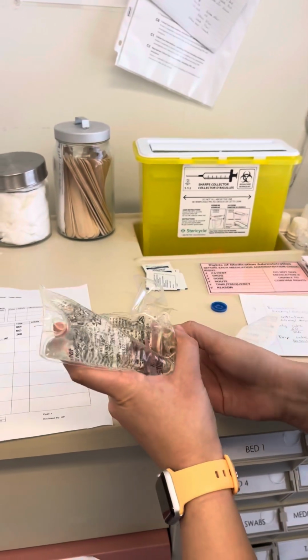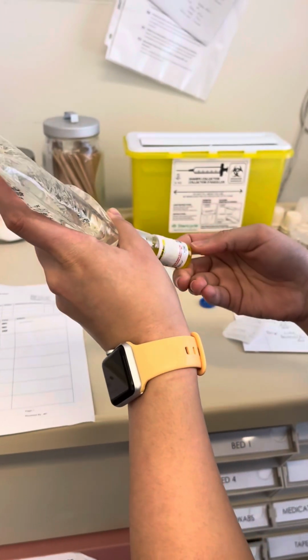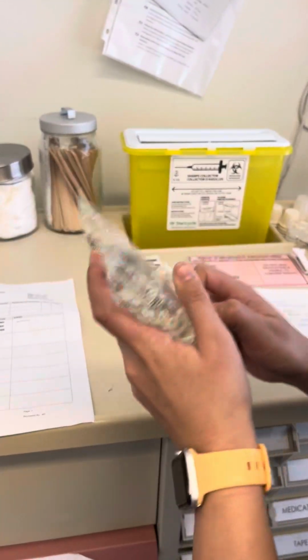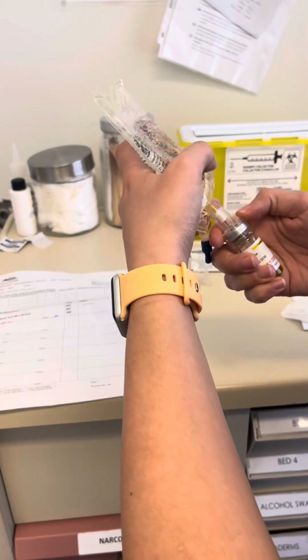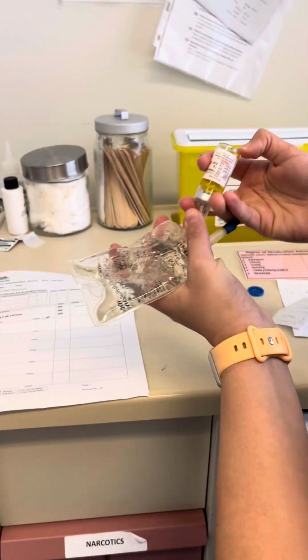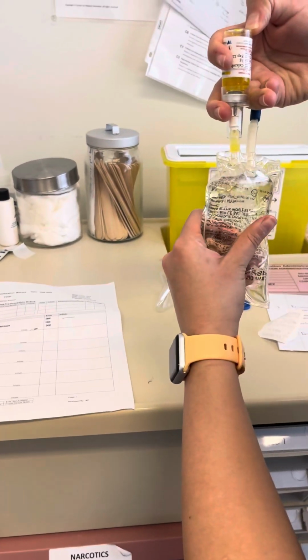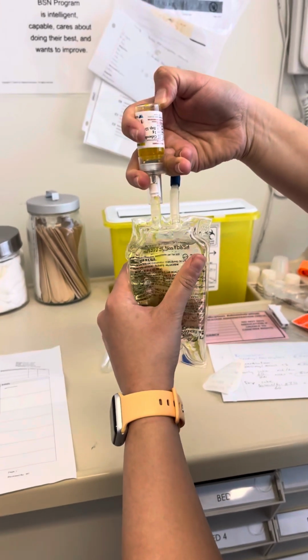May take a minute or so. Okay, that's good now. Okay, this might take a second here.